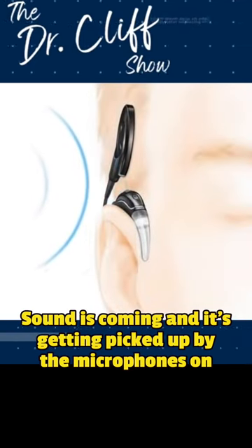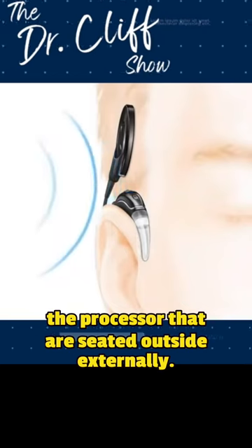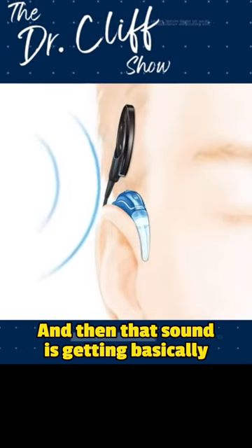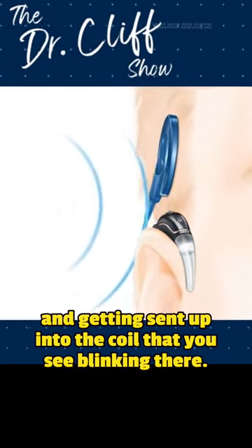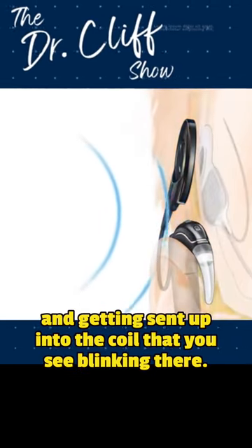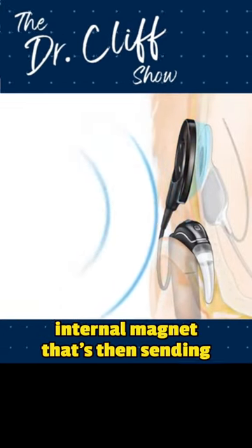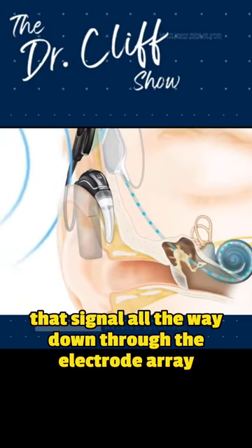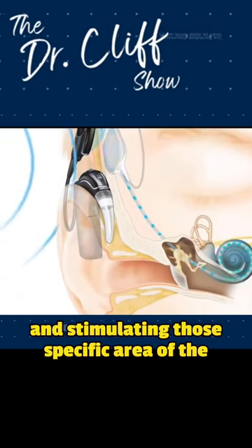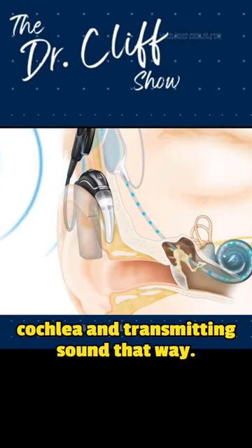Sound is coming and it's getting picked up by the microphones on the processor that are seated outside externally, and then that sound is getting digitally processed through the processor and getting sent up into the coil that you see blinking there. That coil is now sending that sound to the internal magnet, which is then sending that signal all the way down through the electrode array and stimulating those specific areas of the cochlea and transmitting sound that way.